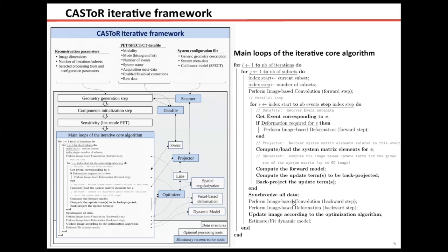Then, if needed, we also perform image-based convolutions and image-based deformation. And we have the update image step according to the optimizer which is in use. Then also, if we want, you can estimate or fit some dynamic model after the update step.